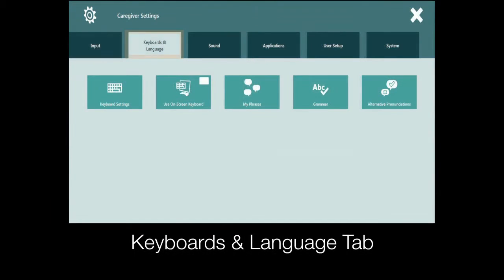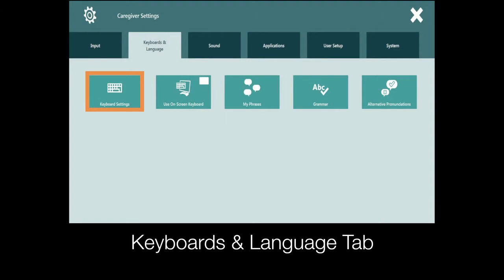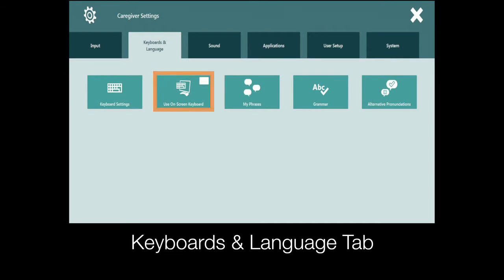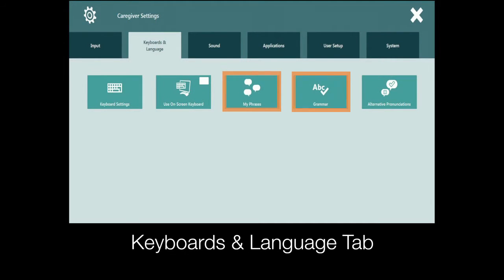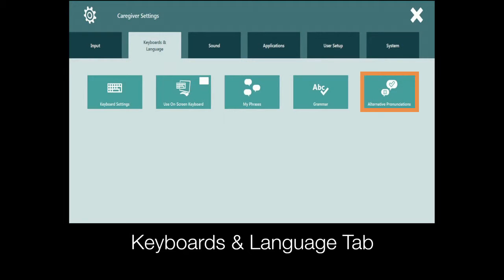On the keyboards and language tab you can choose the preferred keyboard type, turn on or off the on-screen keyboard, manage phrases and grammar, and change the way the software pronounces a particular word if it's spoken incorrectly.